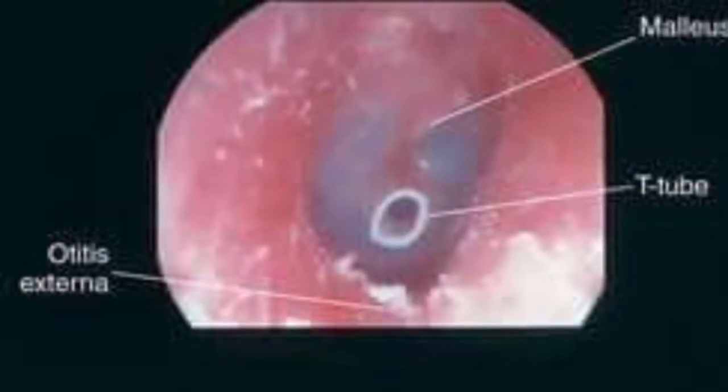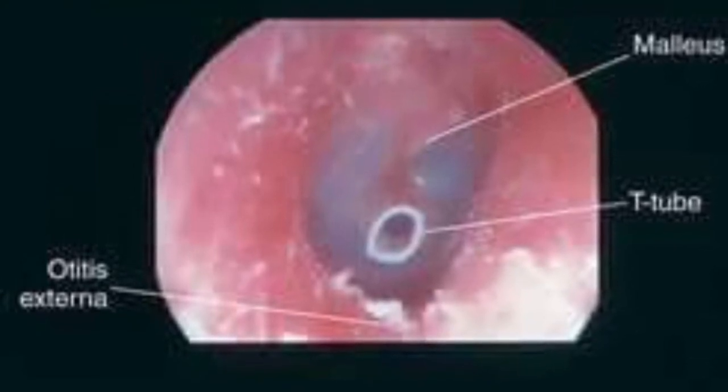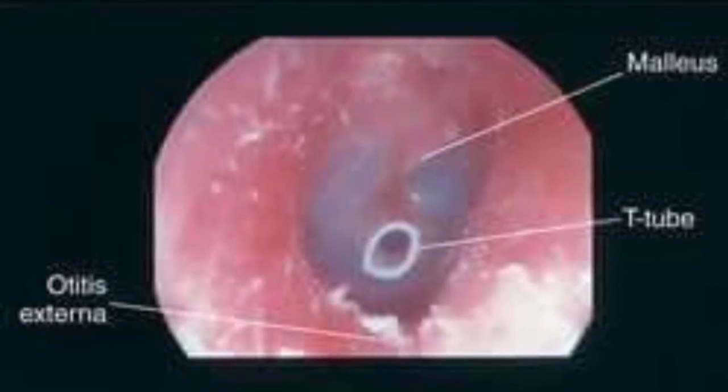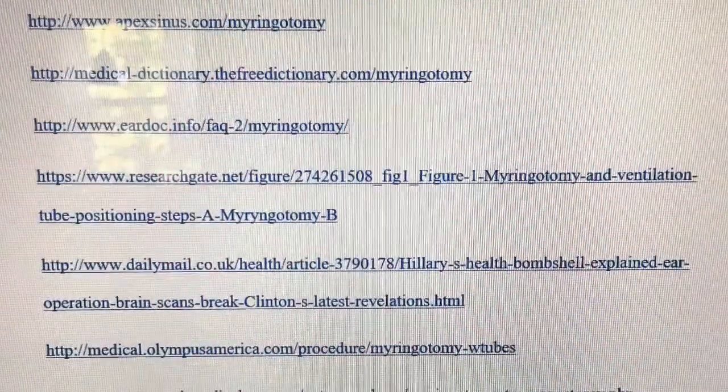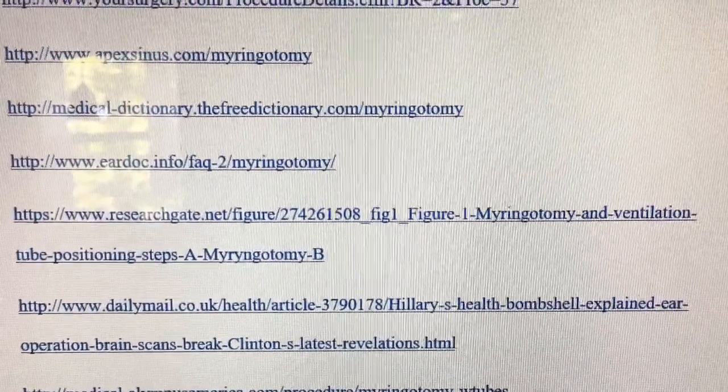Antibiotic and steroid drop combo, or just antibiotic drops, are instilled into the external canal. The speculum is removed and the external canal is packed with cotton. There will be no specimen, and the wound classification is clean.